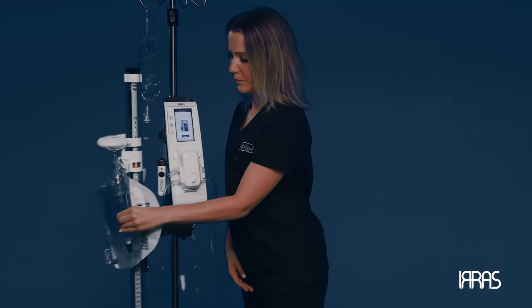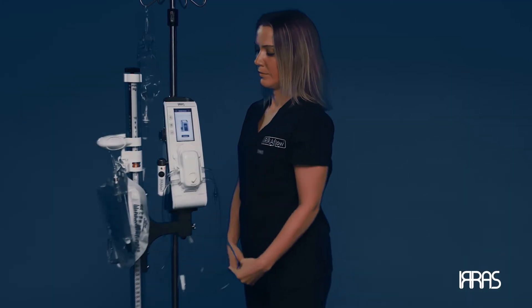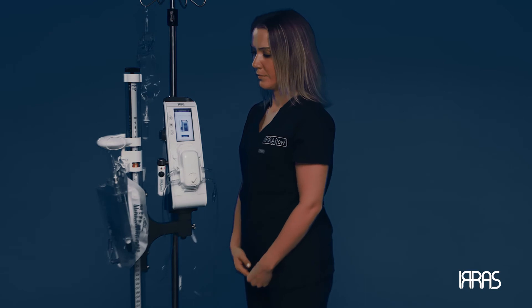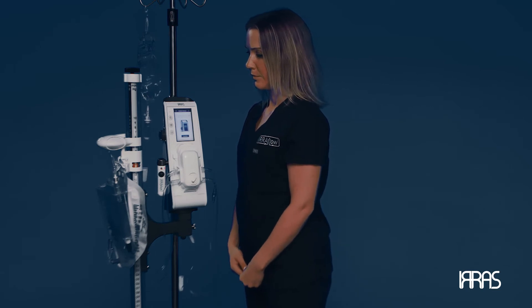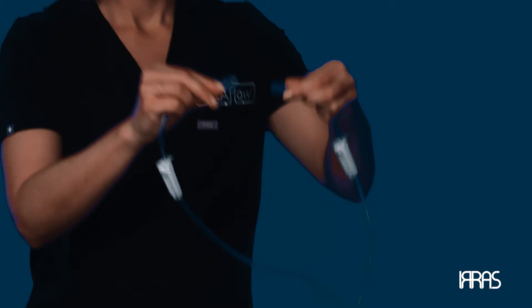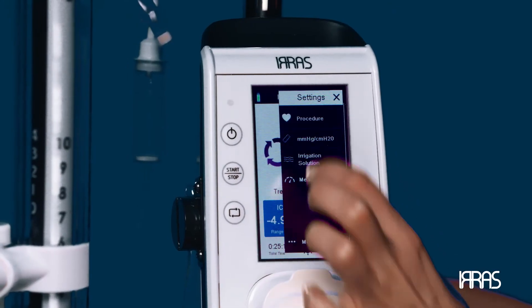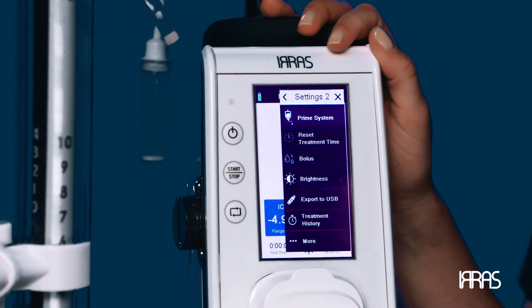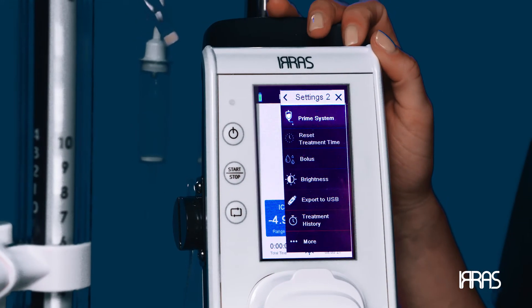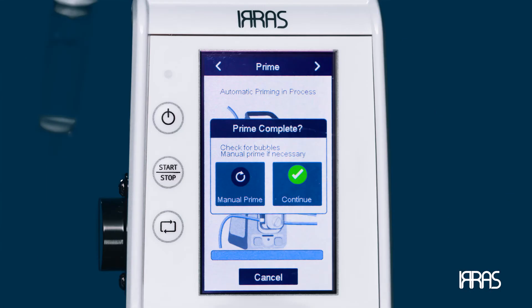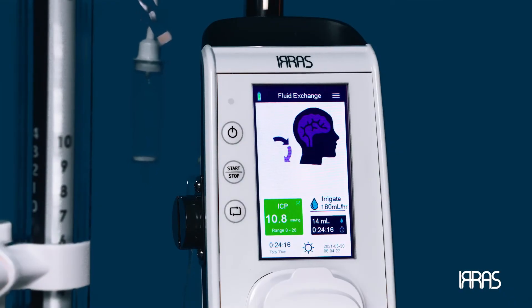Prime — if at any point during treatment you feel the system needs to be reprimed, ensure that you are disconnected from the catheter and connect the irrigation and drainage tubing. Press the settings menu and select the prime system option. You will be able to choose between auto prime and manual prime.